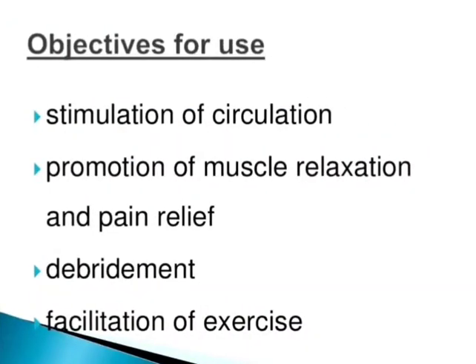Now objectives for use: the stimulation of circulation is the major objective. Also it is used for promotion of muscle relaxation and pain relief. Wound debridement is an important objective that could be achieved by using Whirlpools, especially in burn cases. Then facilitation of exercise.